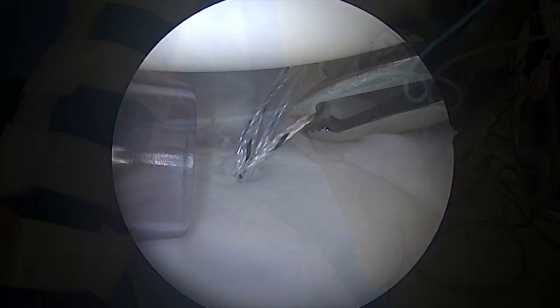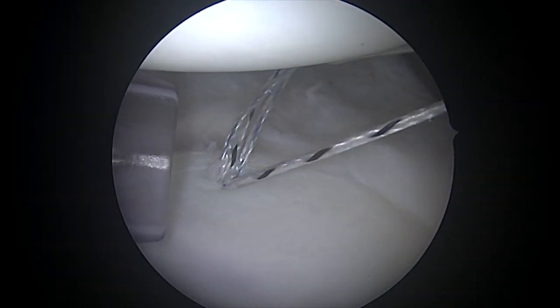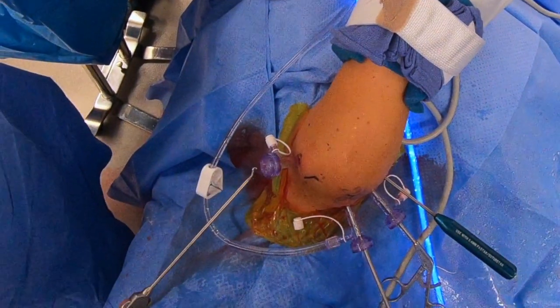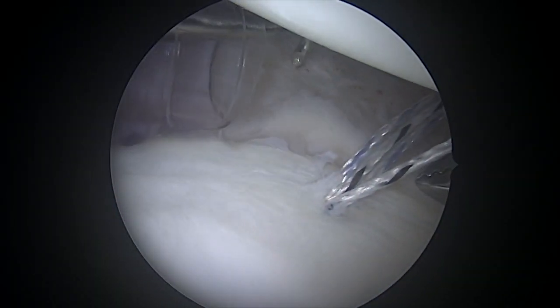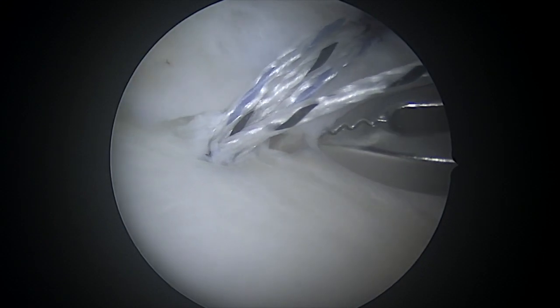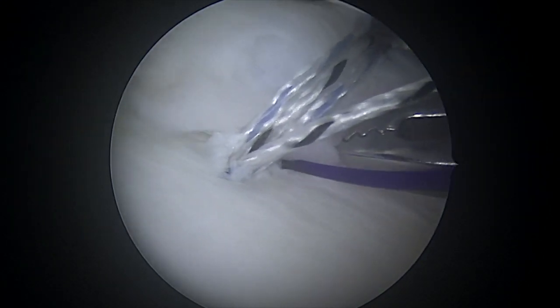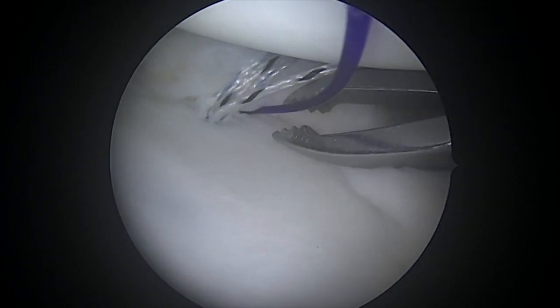The first thing we'll do is grasp our suture from the front so we can isolate that suture. We're going to use this instrument called the spectrum, which is a thin curved needle that allows me to do what's called a retrograde passing. What I'm going to do here is grasp the ligaments — the capsule of the shoulder — bringing that out right where the anchor is.